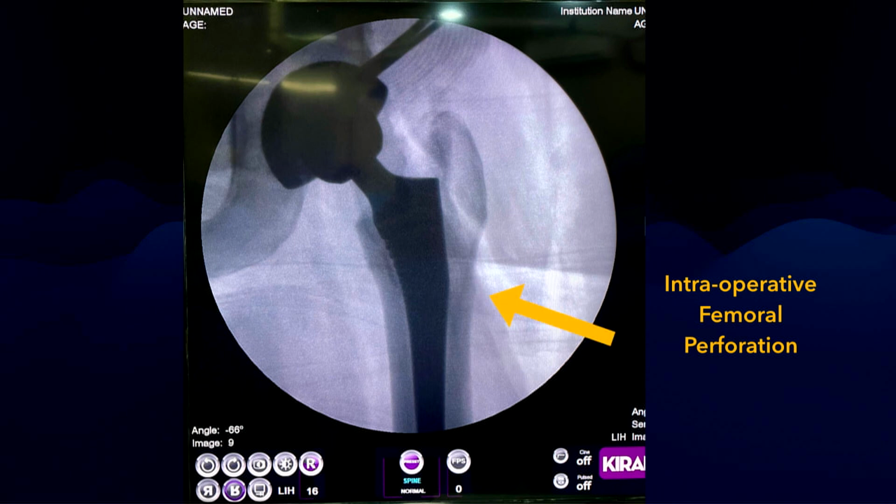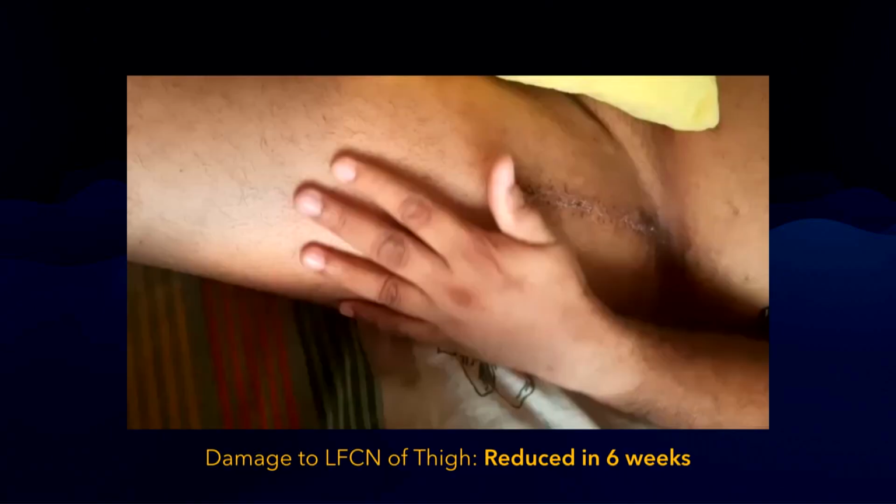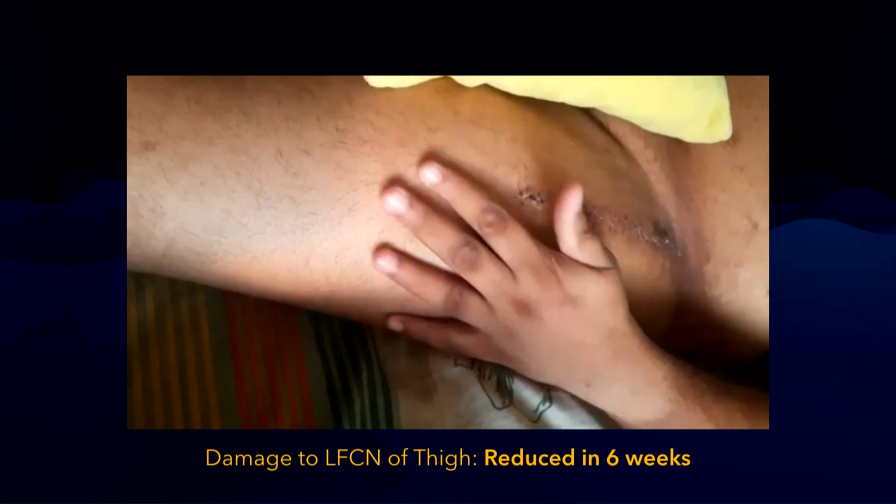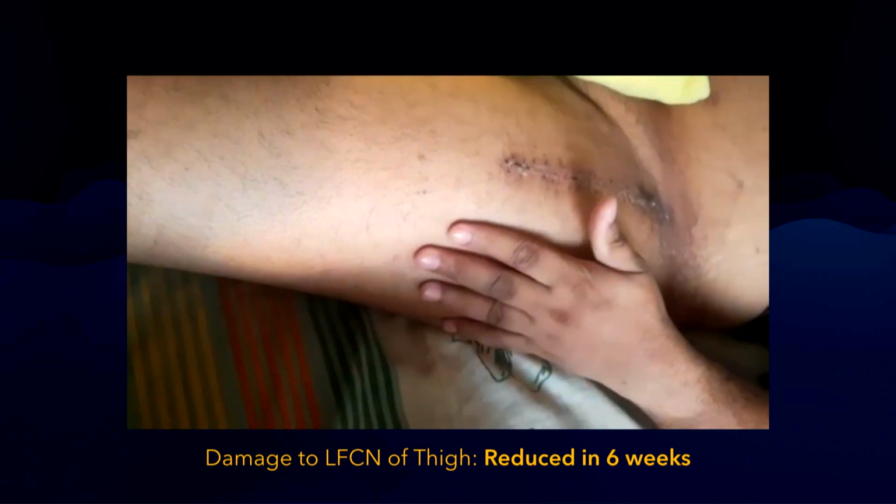This is what you see. I saw it intraoperatively, a perforated lateral cortex. I bypassed it with a stem. And another case where my patient sent this to me, where he said lateral femoral cutaneous nerve palsy, which reversed in about 6 weeks.